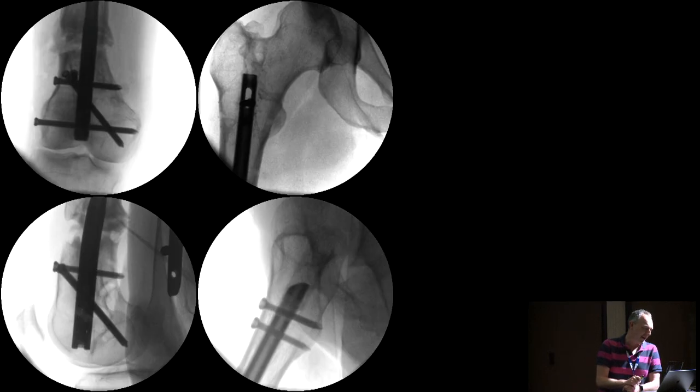Here we complete the fixation. Because it was quite a large opening wedge, I was concerned that when we've got a big open approach like this, you won't get the autograft from the reamings. I've done a couple of these now where I've used a rear reamer simply to ream for the nail, but then you collect the graft and place it manually into the gap. So we've done that, so you can see the hazy blob of bone healing magic in the gap there.